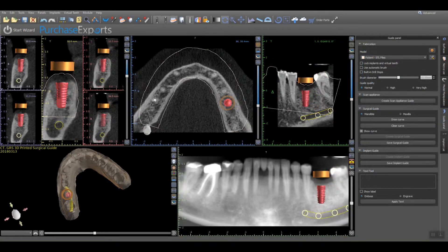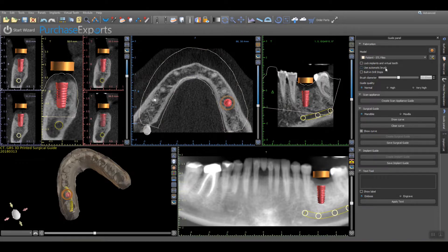To start the fabrication process, confirm the name of the STL model to be used to design the surgical guide. To maximize surgical access at the surgical site during the procedure, check the box associated with Use Automatic Brush, which will remove any unnecessary surgical guide material covering the adjacent teeth. A setting of 15mm is usually sufficient but can be manually adjusted with the slider bar to the right of the brush diameter heading.